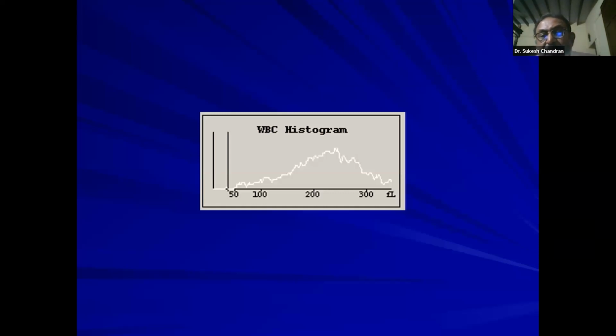Now, if you see a WBC histogram like this, you must realize that I can't see a lymphocyte, but lymphocytes are there. If the lymphocyte peak cannot be seen, that means the peak on the other side is so large, maybe the white cell count is 300,000, 3 lakhs. That's why the lymphocyte is dwarfed. Now, what is the 3 lakhs? It's predominantly neutrophils, and you can see that it is left shifted. The slant is higher to the left shift. So you can see that there could be metamyelocytes, myelocytes.